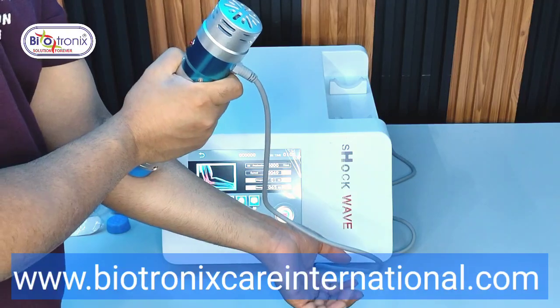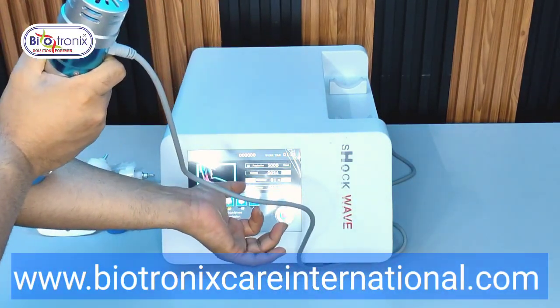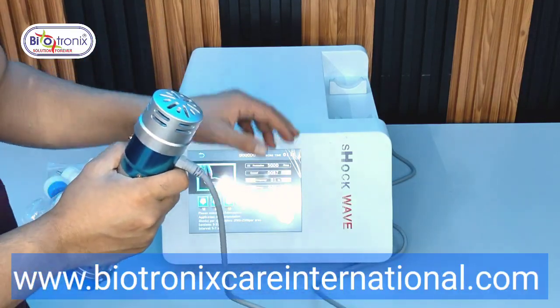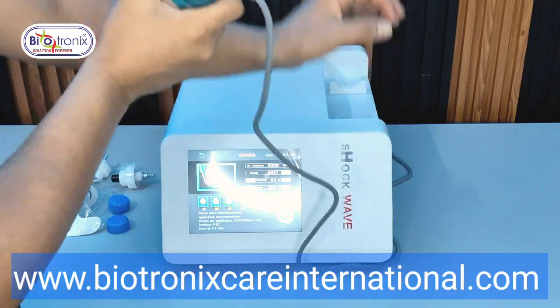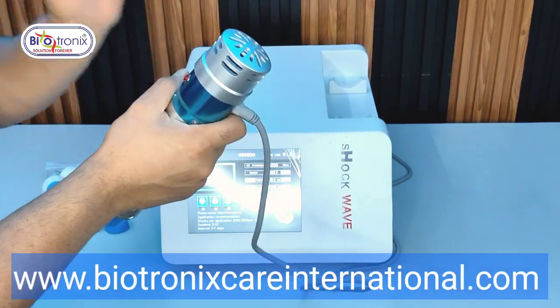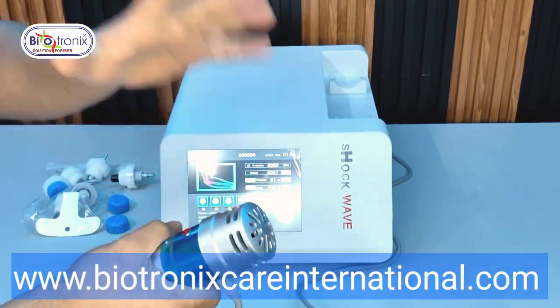So I'm not going beyond that because I may get injured. That is why the maximum intensity over here is 100 millijoule, because at 65 in the elbow section I'm getting quite enough energy. If I go beyond that, I may get injured. So that is why the maximum intensity in that joint is 100, not 200.